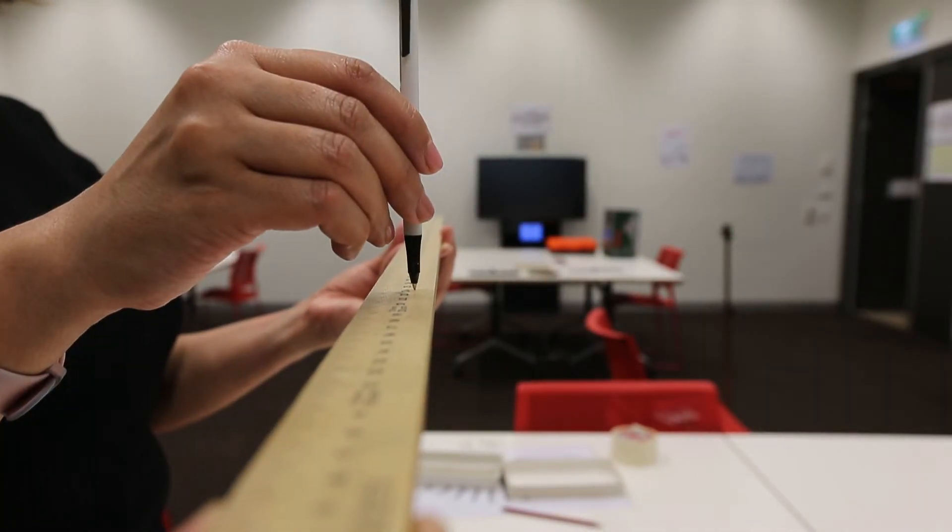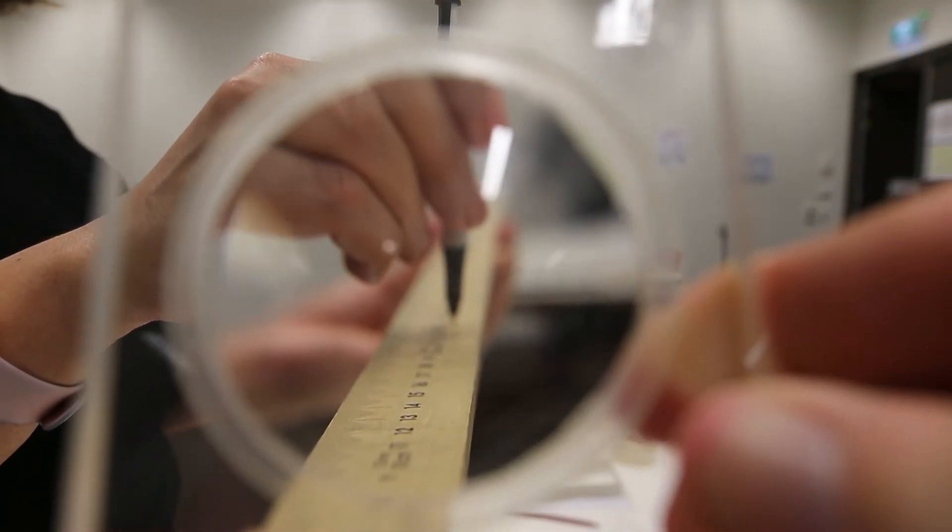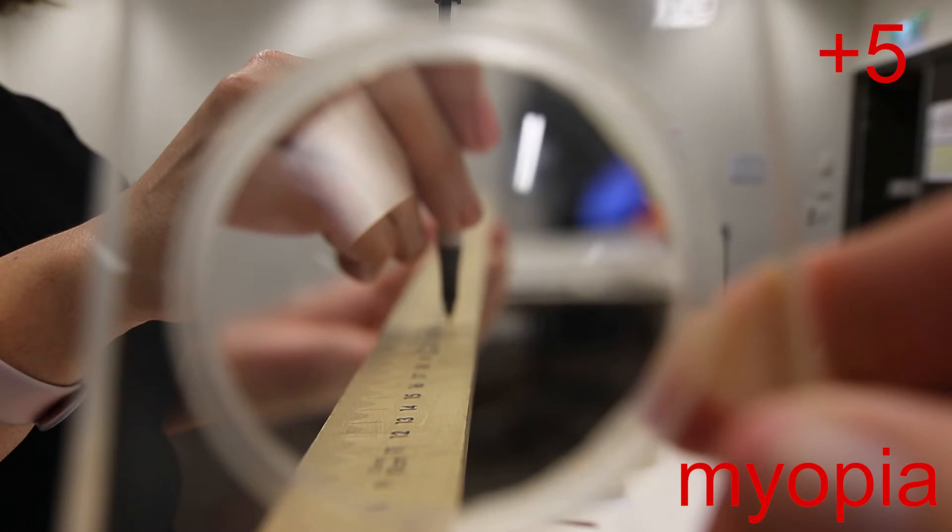So let's have a look at that. Without the lens, you can see that the background is reasonably blurry and we've got the pen in focus at 25 centimetres. Then when we add the lens, you'll notice that the background is really out of focus — so that far point has really been brought a lot closer. You'll also notice that the pen, which was in focus, is now also out of focus. But the numbers that are even closer, around the 13–14 centimetre mark, are now in focus. So your focal point has been brought forward closer to you.